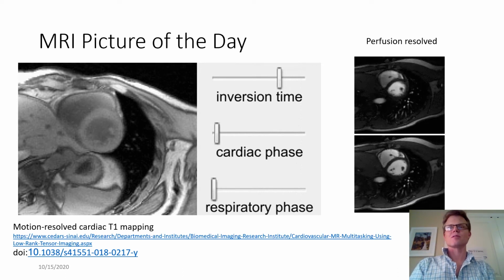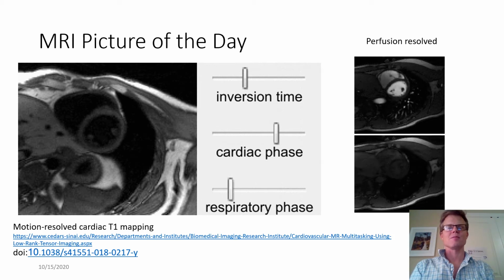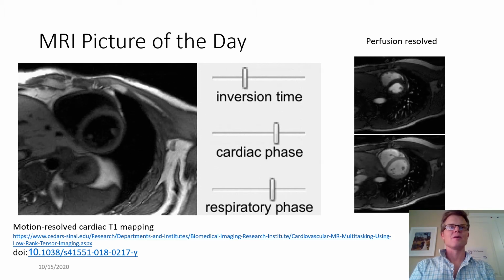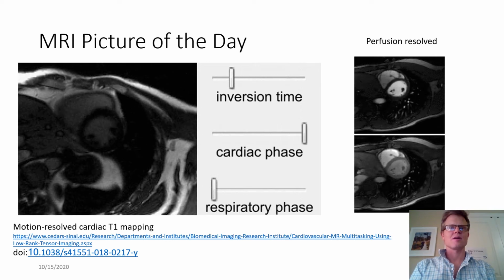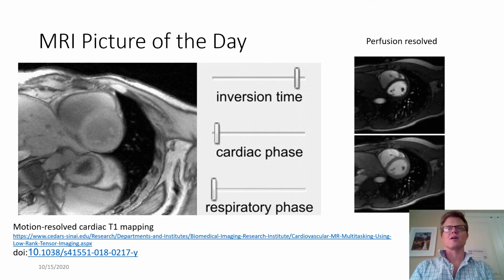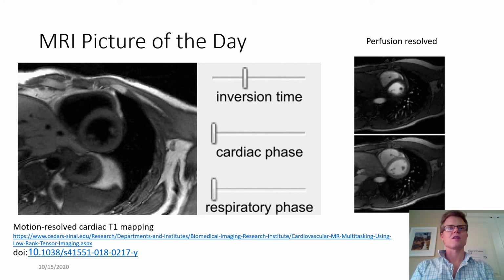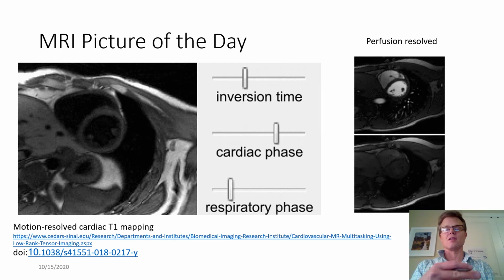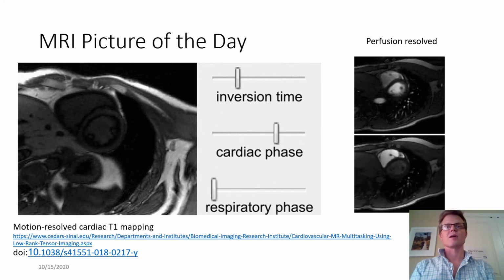As usual, I want to start things with a little bit of a distraction here, just to show some interesting things coming, particularly in the MRI research world. Since we're talking about contrast and inversion recovery, this is an example of using some advanced reconstruction and acquisition techniques to create images that synthesize any of different inversion times, which we'll go into as a powerful contrast mechanism.